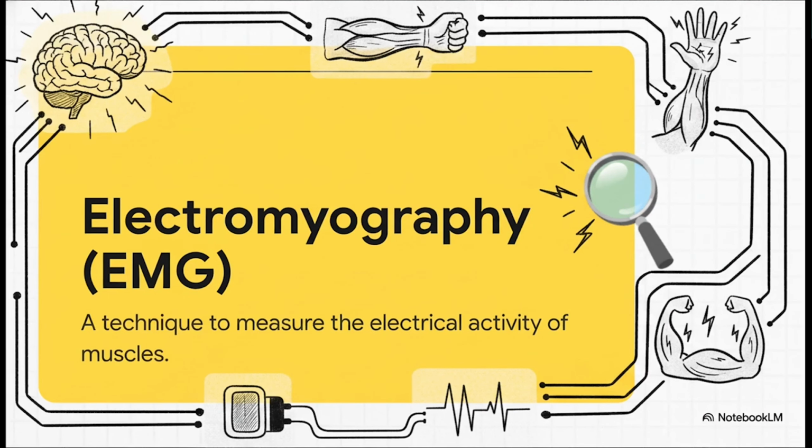Electromyography, or EMG for short, is how we measure the electrical activity produced by muscles as they contract. Think of your brain as a light switch and your muscle as the bulb. Right before that muscle physically moves, a tiny, invisible spark of electricity travels down the wiring to turn it on. EMG is basically the science of eavesdropping on those sparks. It captures that brief electrical burst right before every physical movement, pulling the invisible into the visible world.